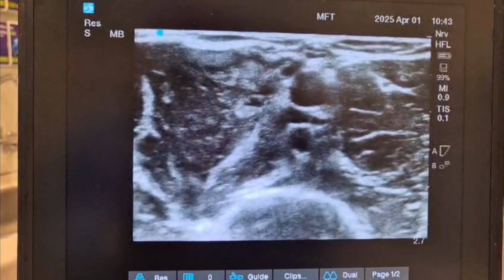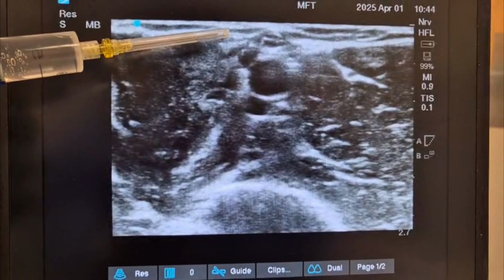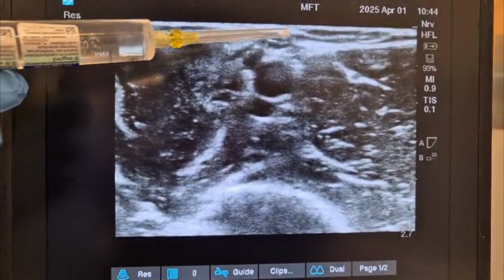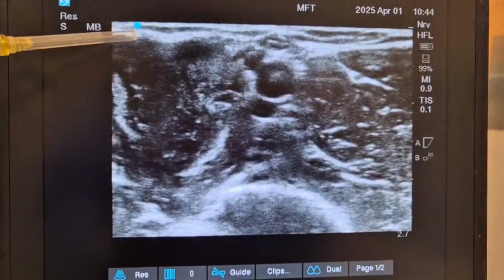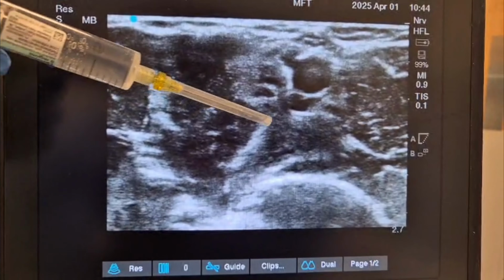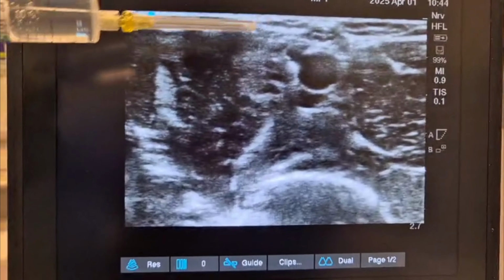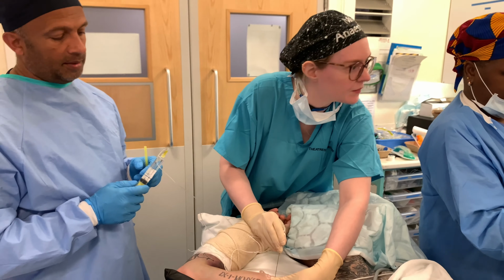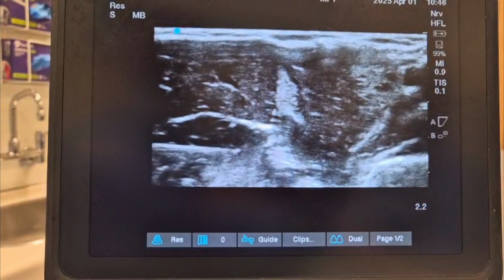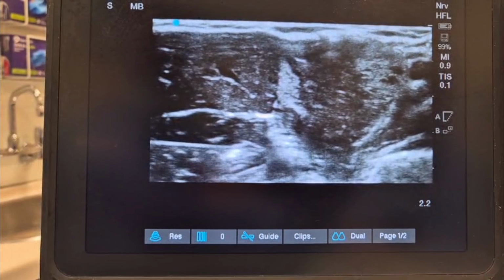They say if it's an awake patient, it might hurt a bit. You need to go here, hydrodissect it, and keep going to the other side and inject it. Okay. And here we'll come underneath, inject it, go here, push it up, and inject it here. Yeah. That's it. Okay. That's fantastic. Look at that needle going to the musculocutaneous. Let's aspirate and inject 2-3 mils there.